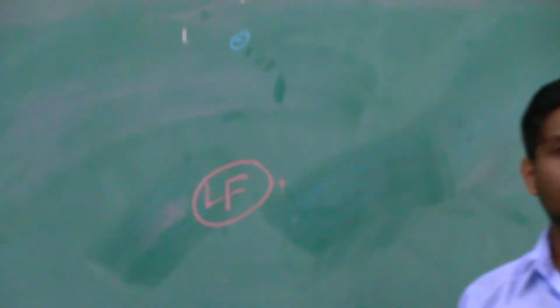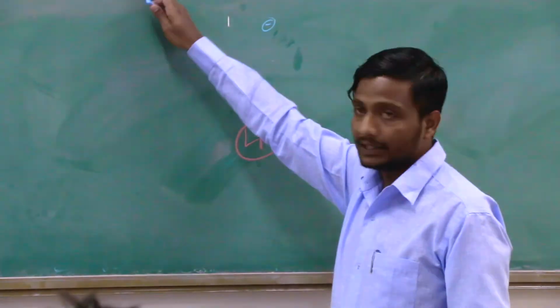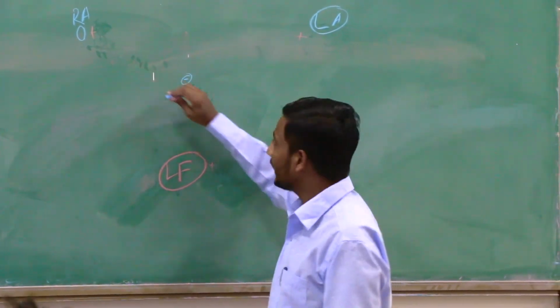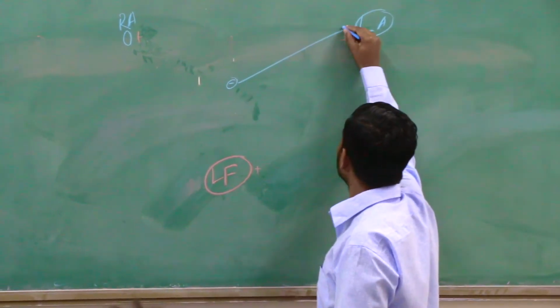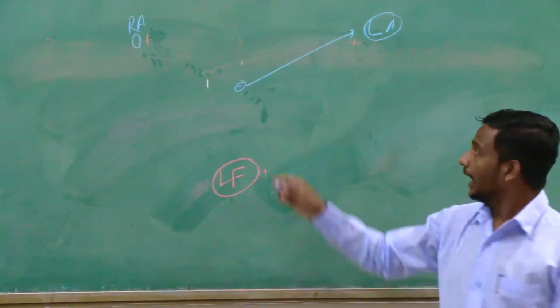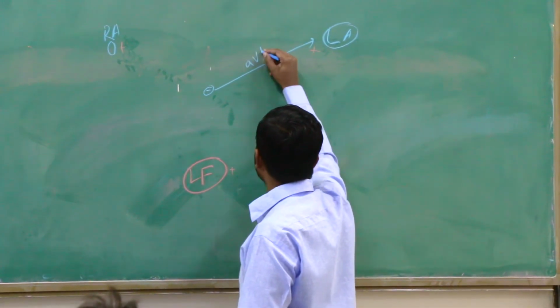And again, I told you another principle. Whenever we think about the axis of an electrode, it always goes from where to where? Negative to positive. So if I put together the axes of the leads produced by these electrodes, then from the center of your body one axis will go to the left arm, from the center of the body to the left arm, and this one we are going to call AVL.